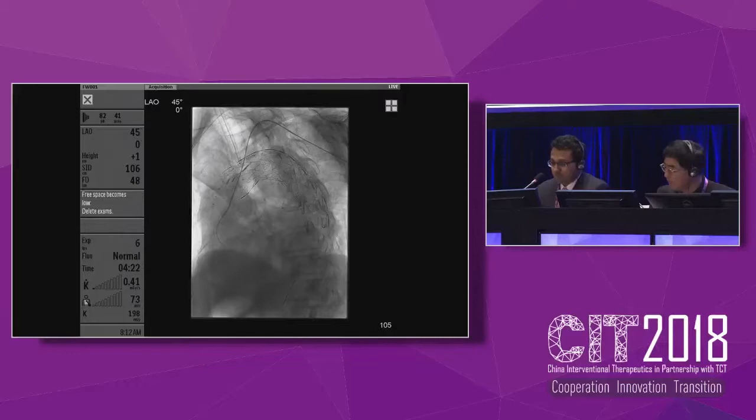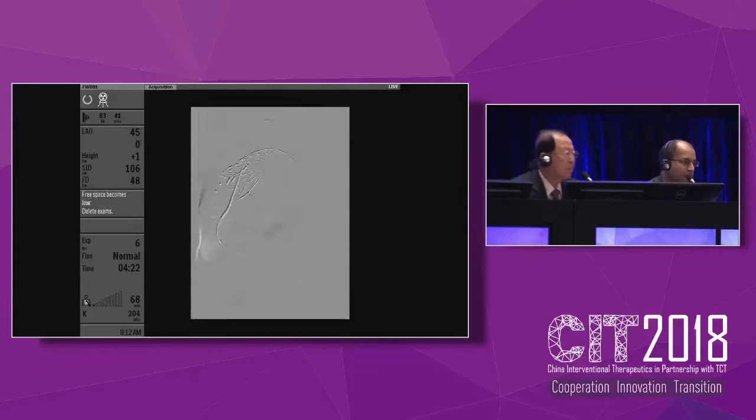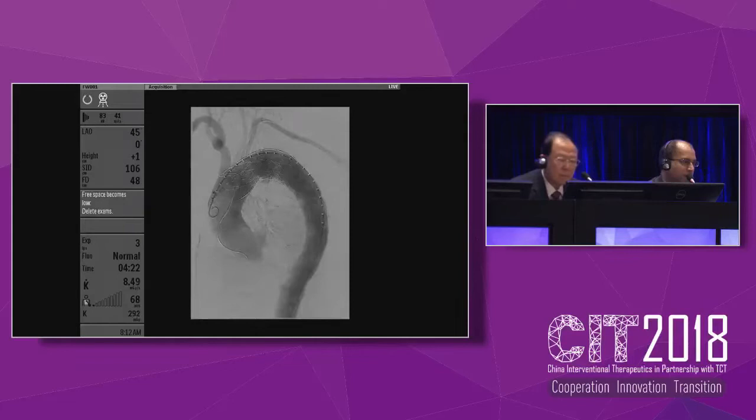So are you going to take an aortogram to see now? Angiogram. Because it looked initially like, based upon both the CT and the initial angiogram, that if the fenestration is lined up properly, you might get a seal without having to necessarily stent graft the subclavian and the carotid, but then you worry that later with migration or otherwise you might not get it.